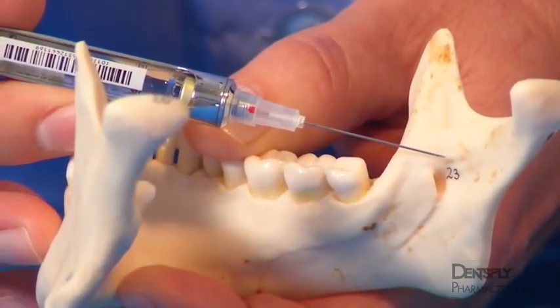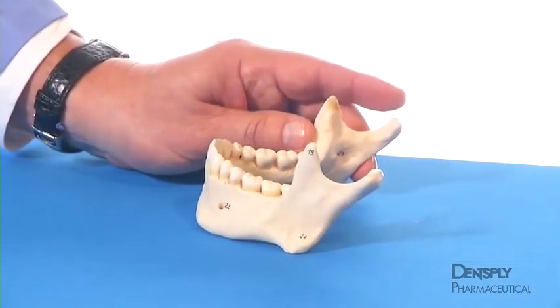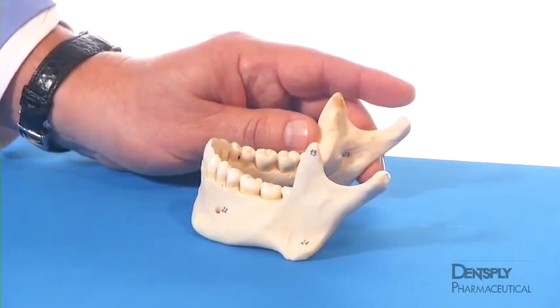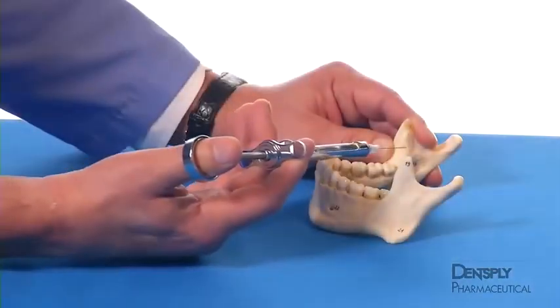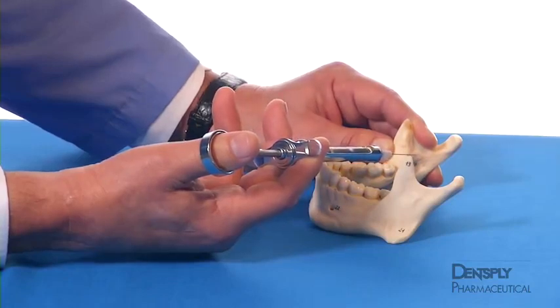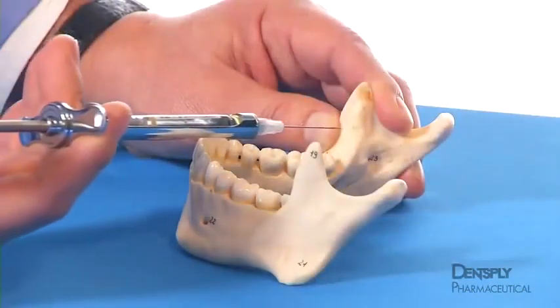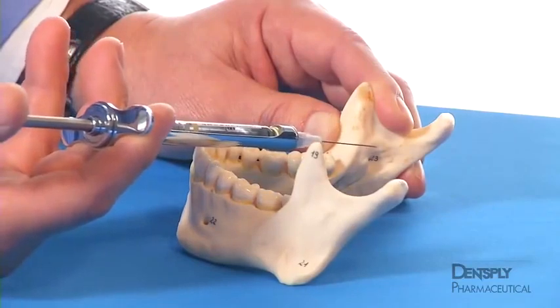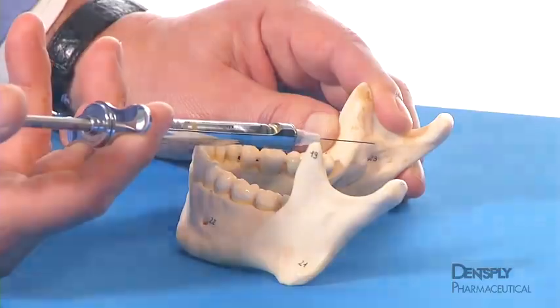Intraoral landmarks are key to this injection technique. The height of the injection is established by the greatest depression of the ascending ramus, the coronoid notch, a concavity on the anterior lateral border of the ramus. With the syringe held parallel to the mandibular occlusal plane and at the level of the coronoid notch, the needle will be in a plane that intersects the mandibular sulcus unimpeded. Because of the lateral flare of the ramus, the syringe must be advanced from the contralateral premolar region for the needle to enter the sulcus.